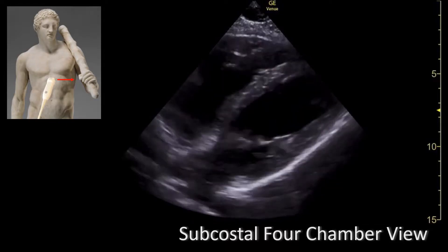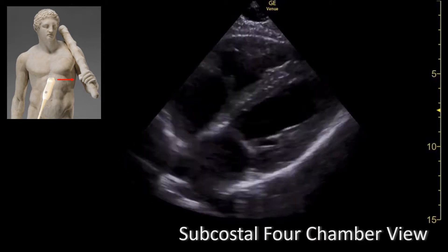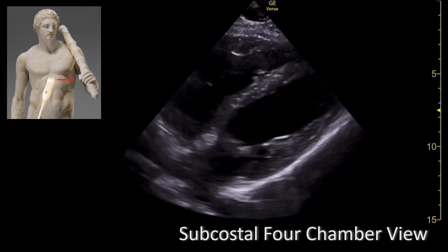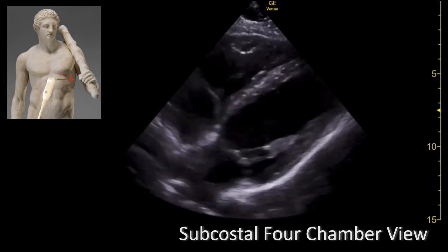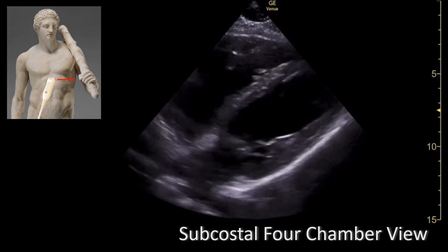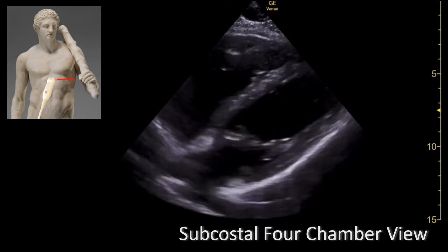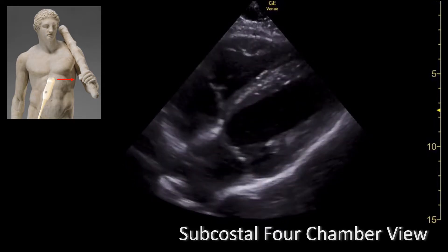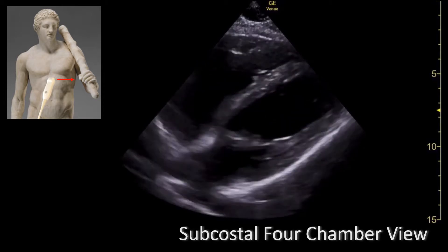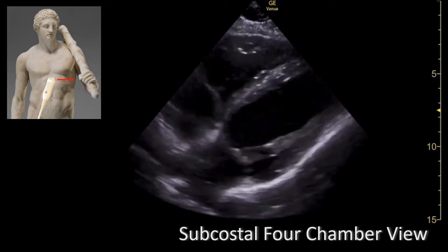This view can be particularly important when the parasternal windows are suboptimal. You can also use this view to assess the interatrial and interventricular septa for defects, as well as the right ventricular free wall thickness, as the ultrasound beam is perpendicular or almost perpendicular to those structures.